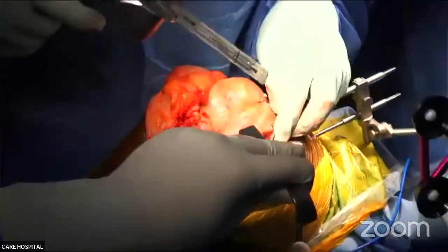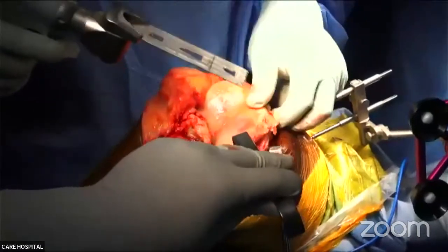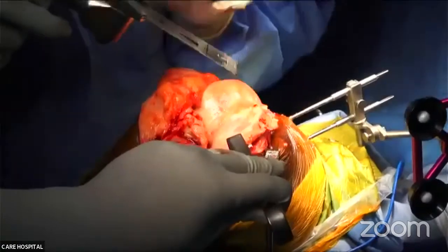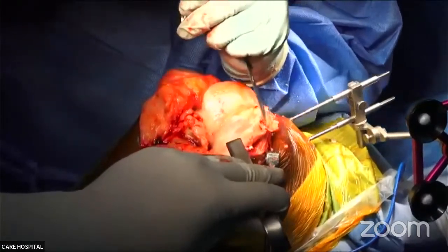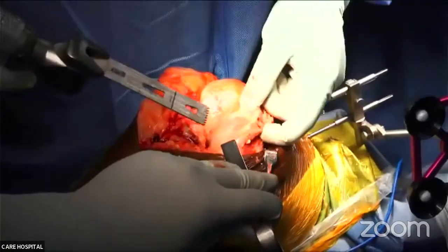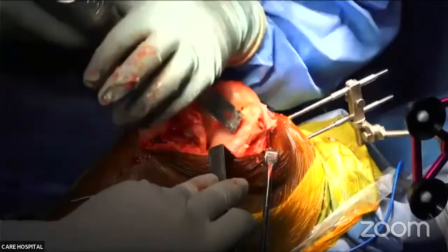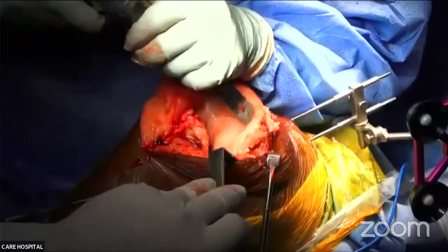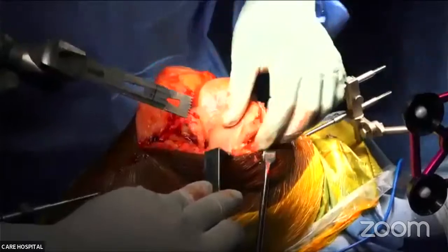Is it necessary to remove the osteophytes? It's better because then your gap balancing will be better. Posterior osteophytes are difficult to remove, but medial osteophytes, it's always better to remove before you do the gap balancing. Especially this patient is having huge ones.